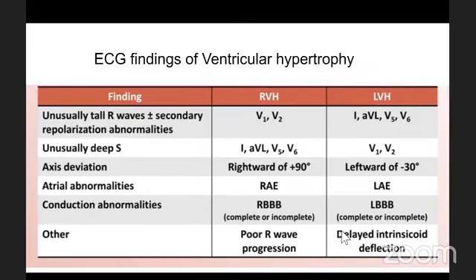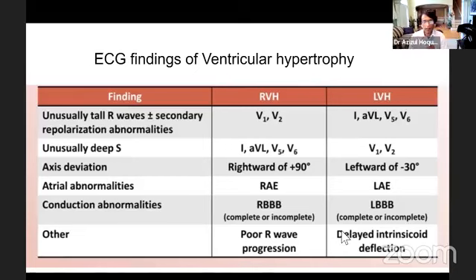They need to keep in mind that chamber enlargement happens for a few reasons, right? One is pressure overload, or afterload, where stress is high in a certain area, and valvular problems, but they are also connected. So in that situation, this is one component they have to keep in mind, and the second component is what the axis is on the ECG.